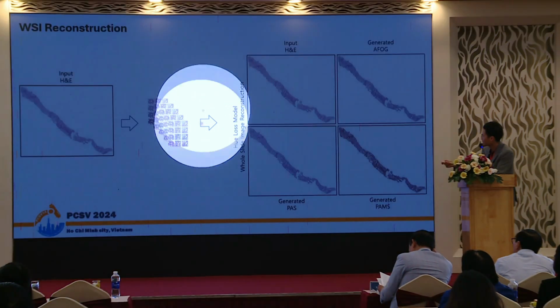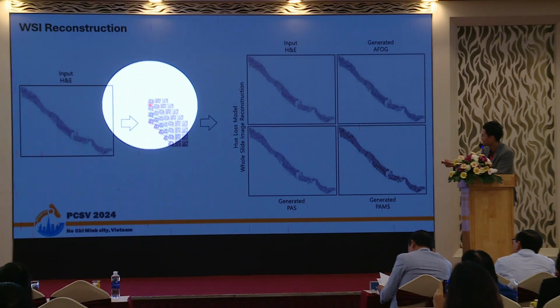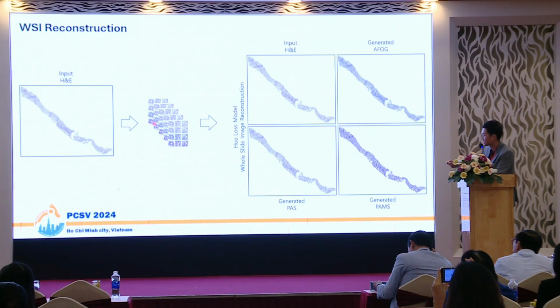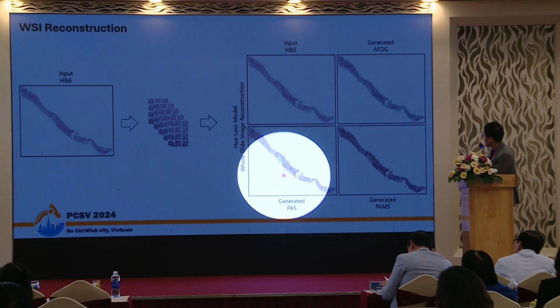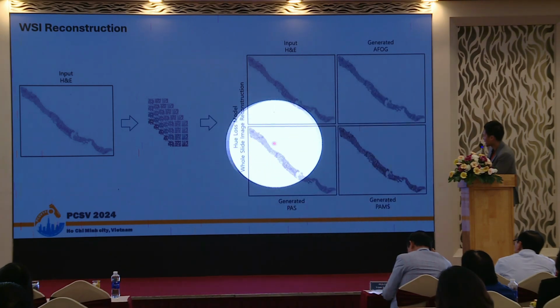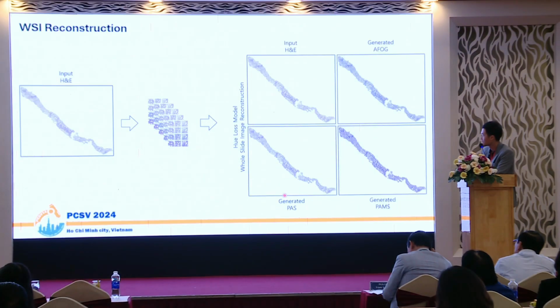And after the stain transfer of the individual small patches, I stitched them together to make them like a real whole slide-like image, but they are not actual stains, but generated images.